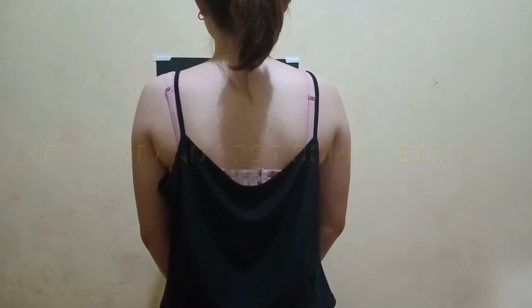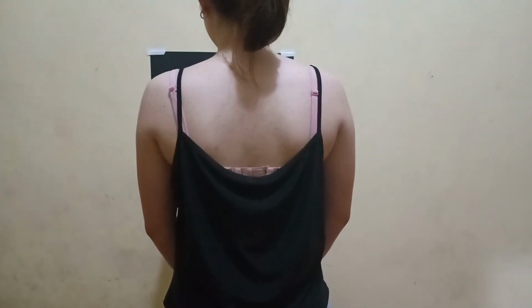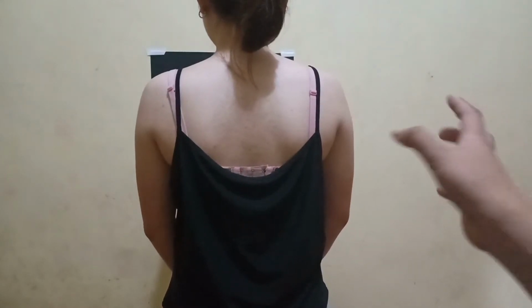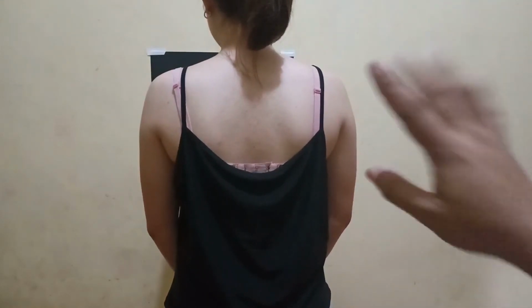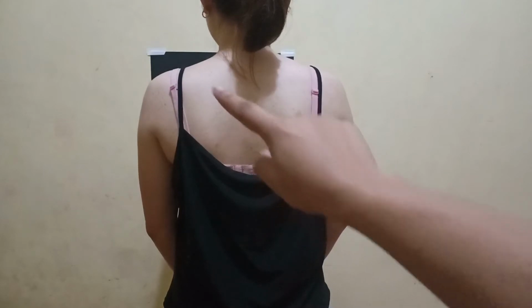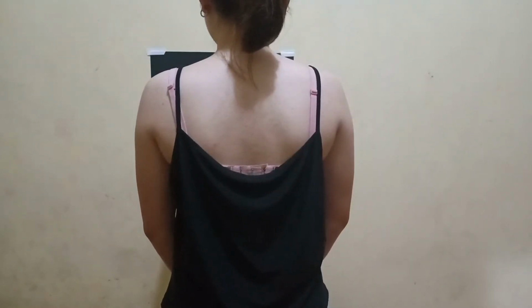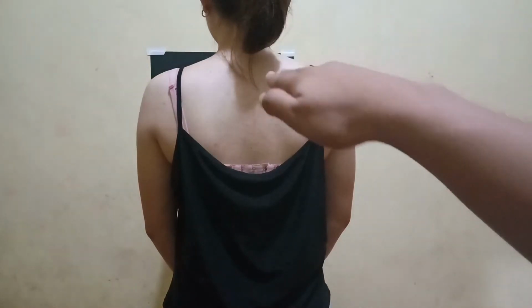Next is the part position. With the patient facing the IR, rotate into an anterior oblique position as for a lateral scapula. Then palpate the superior angle of the scapula of the patient and also the AC joint articulation. Then rotate the patient until an imaginary line between those 2 points is perpendicular to the image receptor.